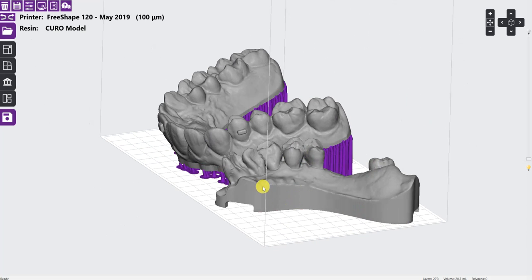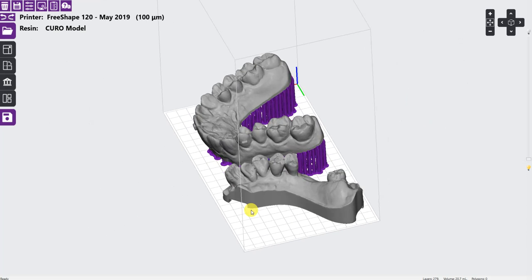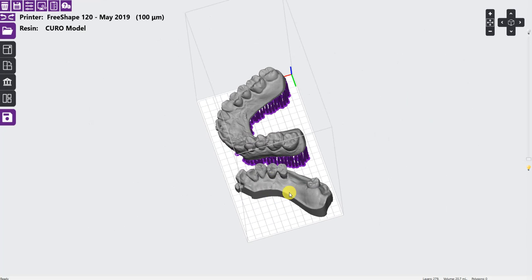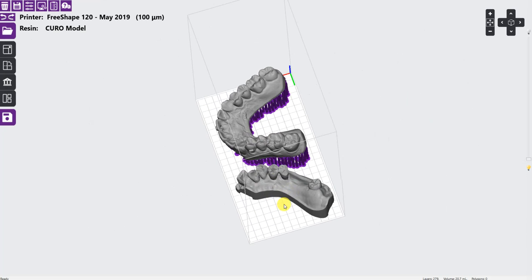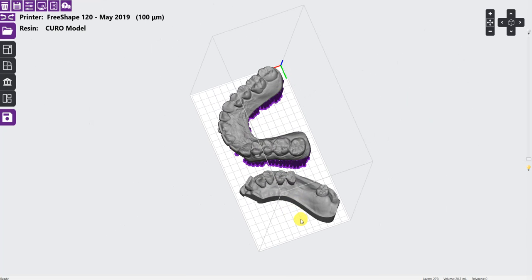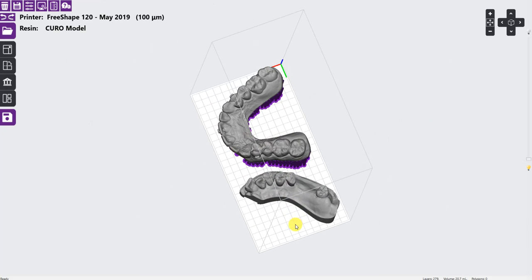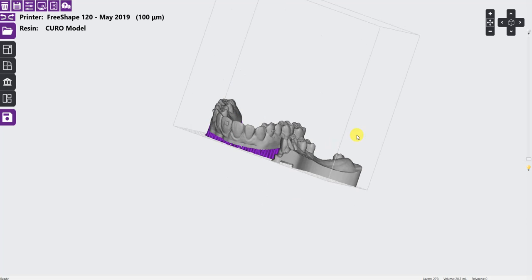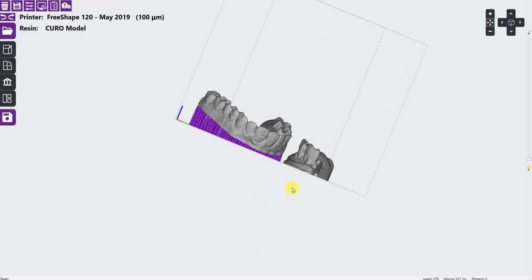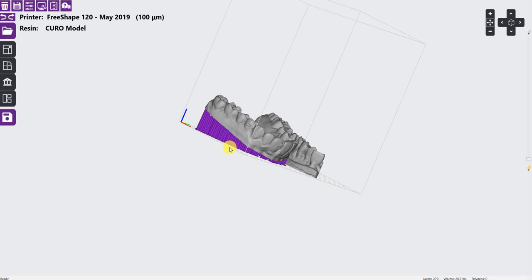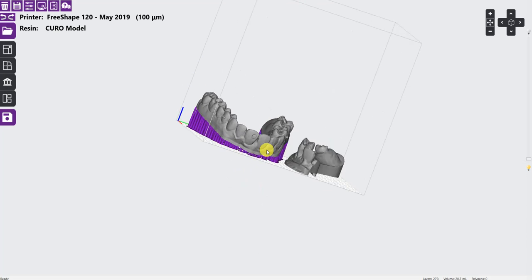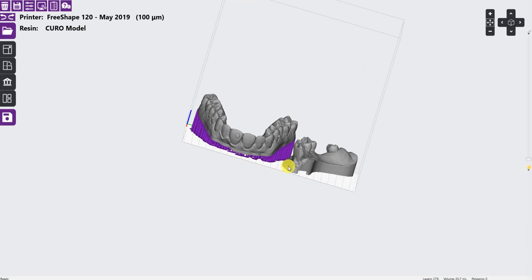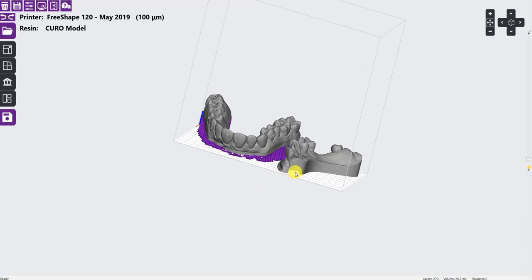We performed two tests. For the first print, we printed two models. As you can see, one is tilted by adding supports. The second has a weep hole to release any pressure.